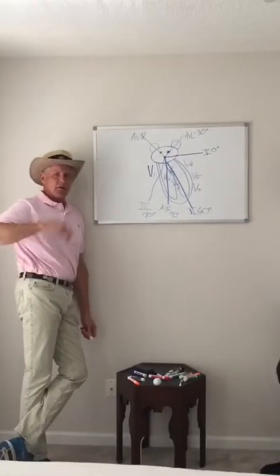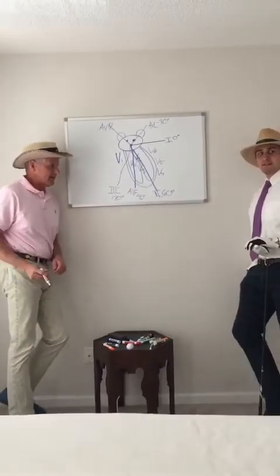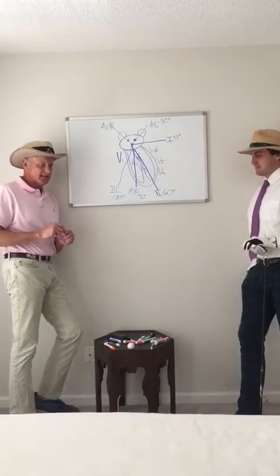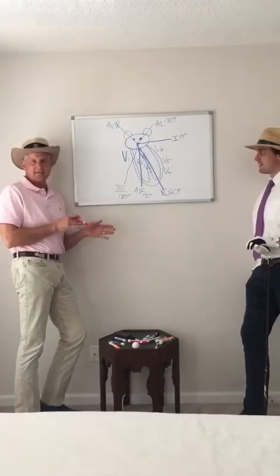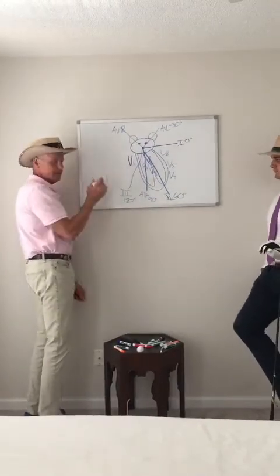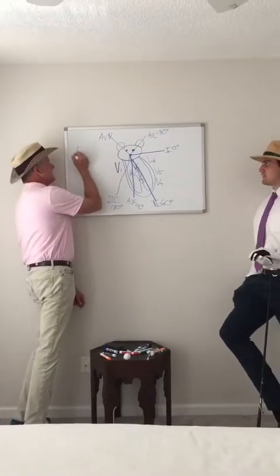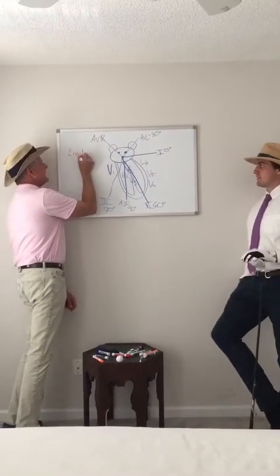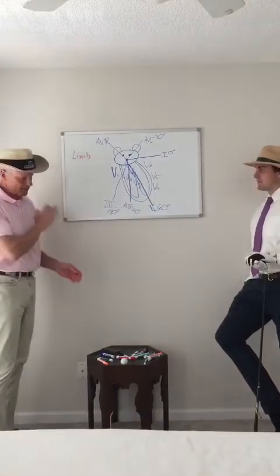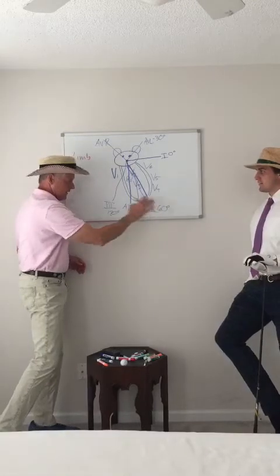So what we have here are a lot of leads, and you did a really good job of that. But what we didn't tell you is that of the leads, there were 2 sets of 6. So we have the leads Will was talking about with the whiskers. They're called the limb leads. You've got to know that. Now, the limb leads are the leads we use to calculate the axis, and that's all I was telling you about the vector moving to Will over there, the resultant vector.